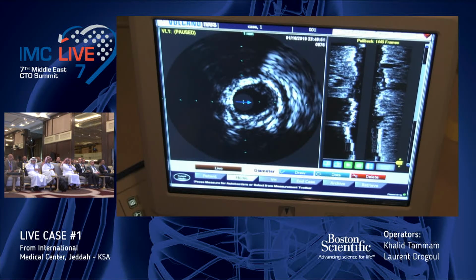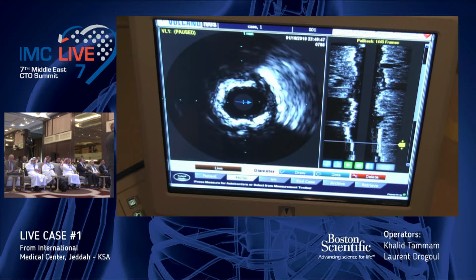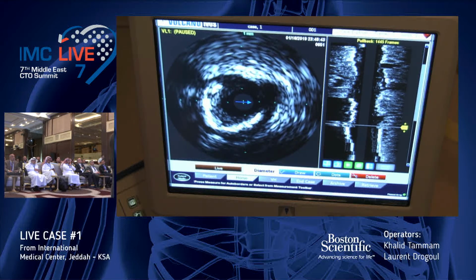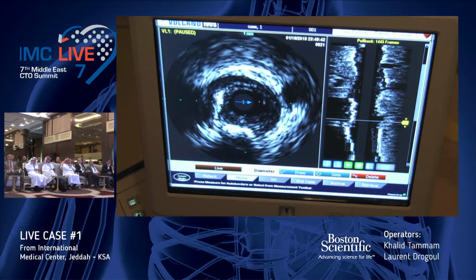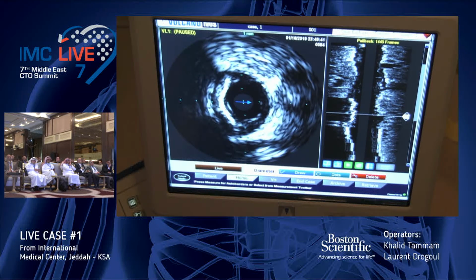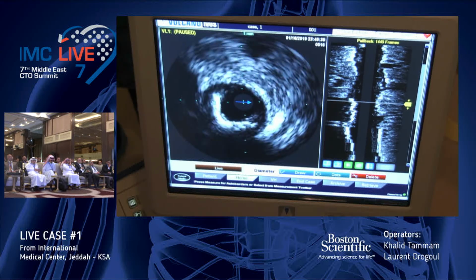The point is, if you plan to do rotablation, no, I don't think so. After this, I'm not sure what works. Okay, do you hear me? Yes, now yes. From what I see of the plaque here, you have 90 to 180 degrees of superficial calcium, but on the other side I see finally a lumen that is not severely calcified, that you would need rotablation.